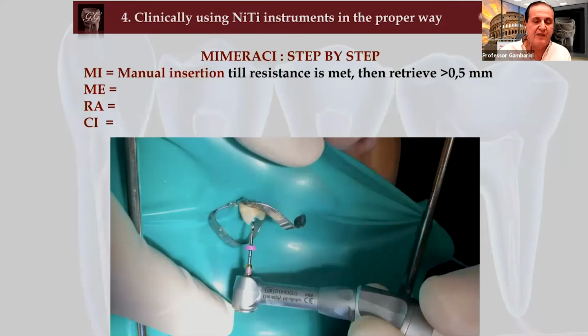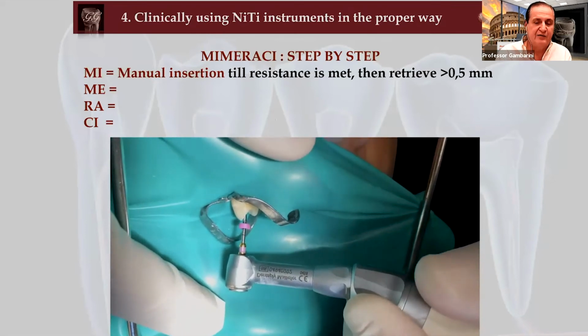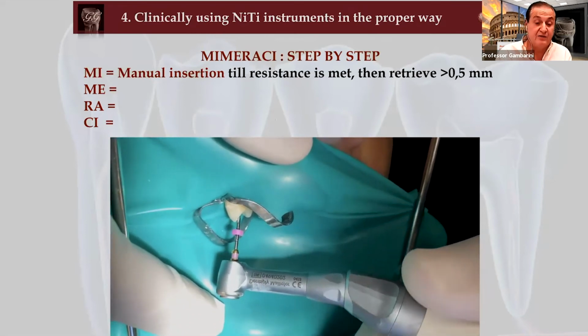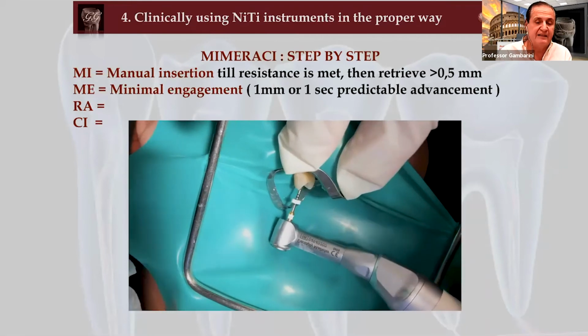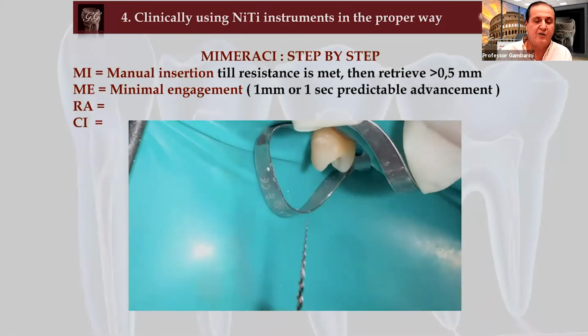So, very easy: manual insertion. You insert the file until you feel resistance. Then, if you want, you may also slightly retrieve it a little bit. And then you progress only for 1 millimeter or 1 second of predictable advancement.